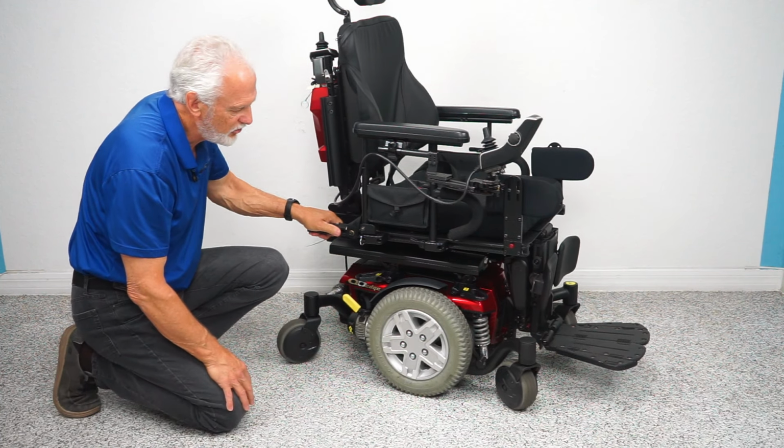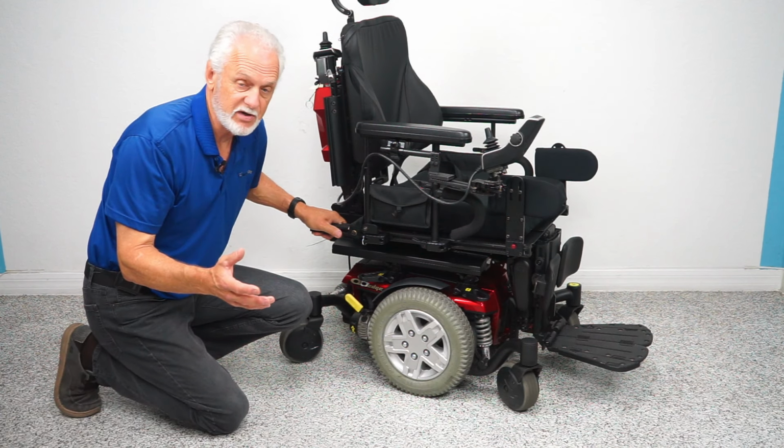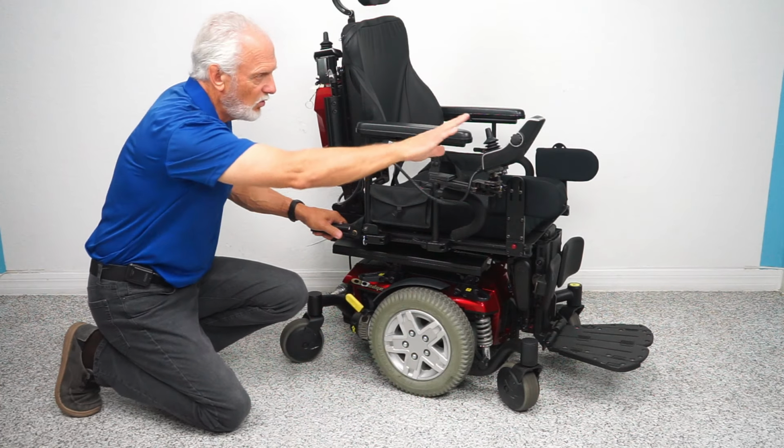If you want to put the chair in neutral, you can see it's in gear, and you want to roll it. If you had an issue, hopefully you'll never have an issue, but if you have an issue, you just turn the power off. These are electric motors. You don't want the power on.